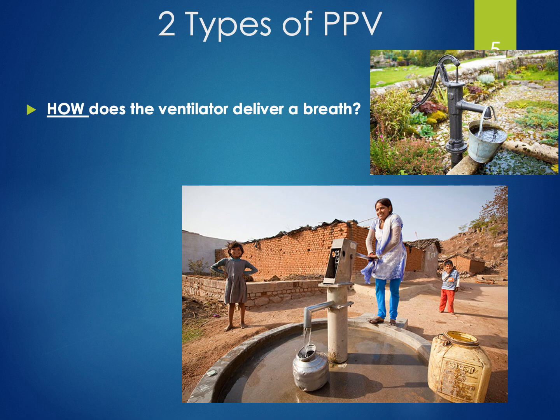Now, what if instead somebody said, fill the bucket up exactly halfway? Now you're focusing more on the bucket. You still have to push down to get water, but you're not so focused on that 10 out of 10 or 8 out of 10. Instead, you're trying to push just as hard as you can to fill the bucket up exactly halfway. So either way, the bucket gets water in it. Either way, you're pushing on the lever on the pump. But one way, you're focused on how hard you're pushing on a scale of 1 to 10, and the other way, you're focused more on the bucket and how much water you got in the bucket. So let's look at you standing by the water pump as a mechanical ventilator. And then the bucket that's waiting to be filled up with water is your patient's lungs.